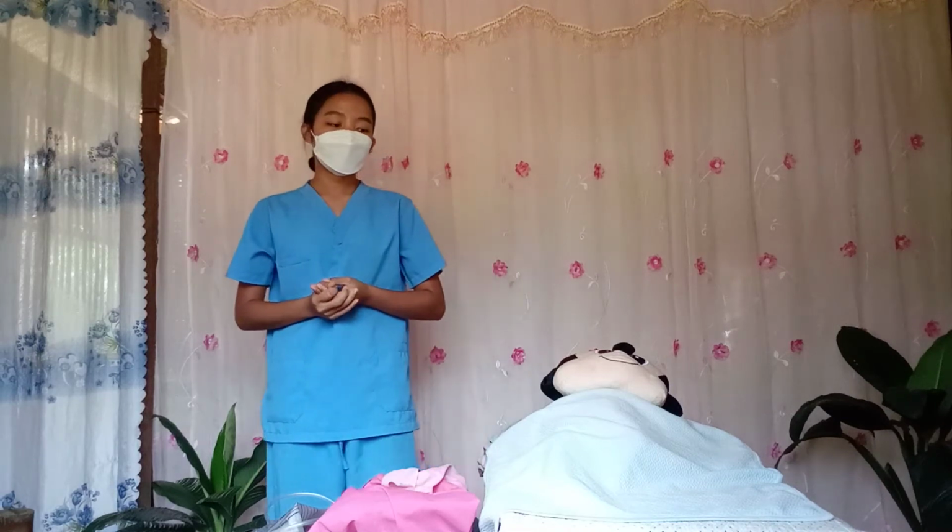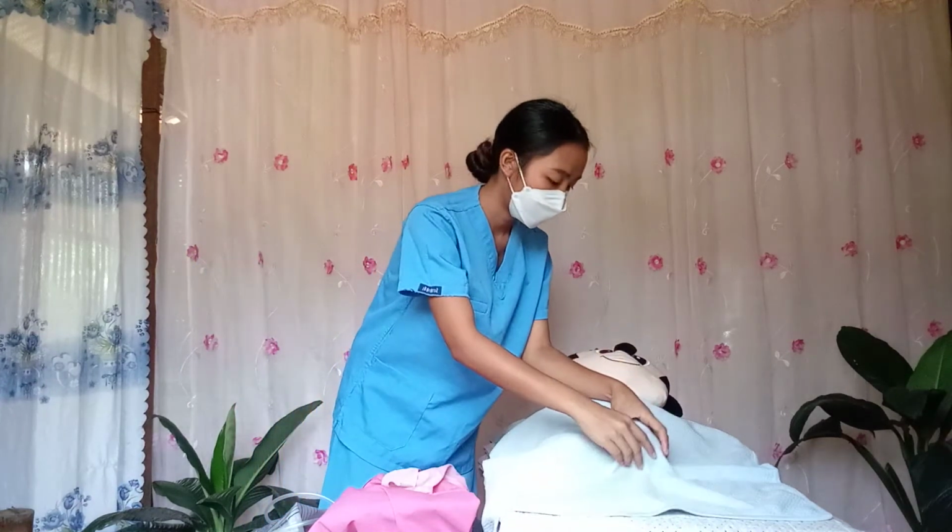After that, let's proceed to the procedure. The first thing that we're going to do is position the patient in dorsal recumbent with knees flexed. This is for good visualization upon doing the procedure. Thank you so much, ma'am.